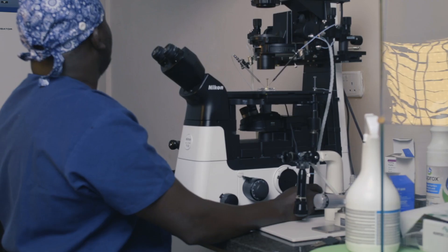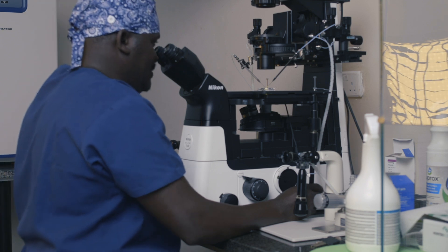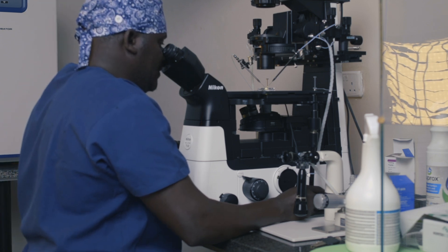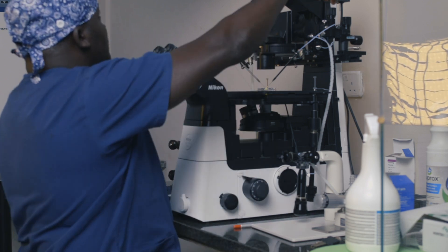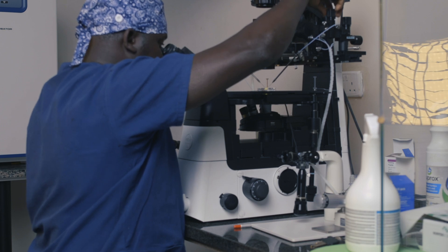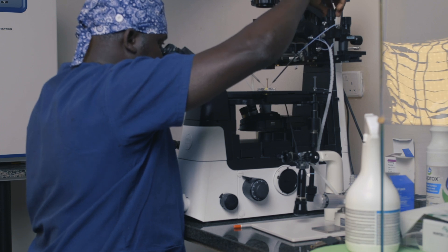Here is where I'm going to do my injection. As you can see, those are the sperm cells that I've added. I have to catch one sperm at a time.